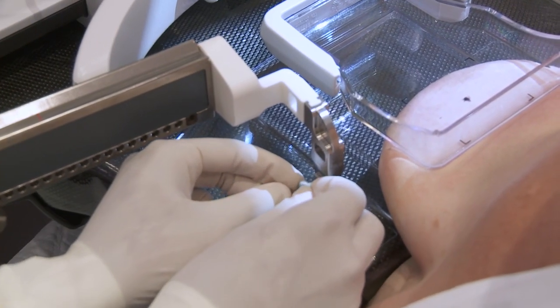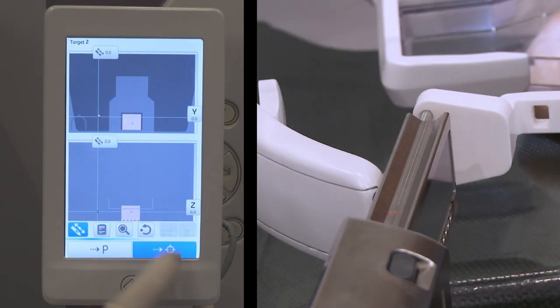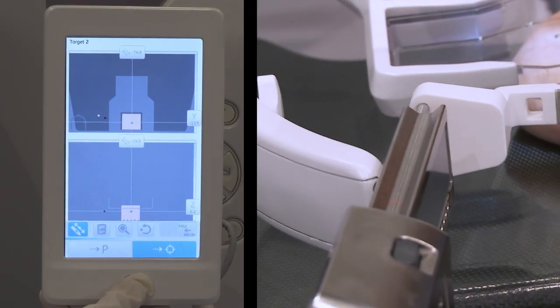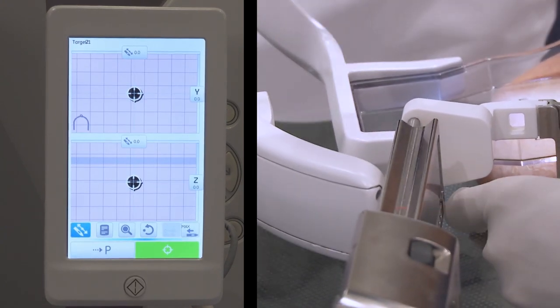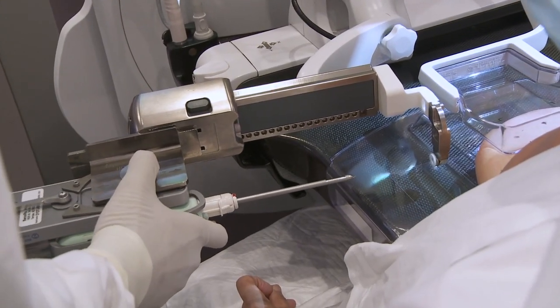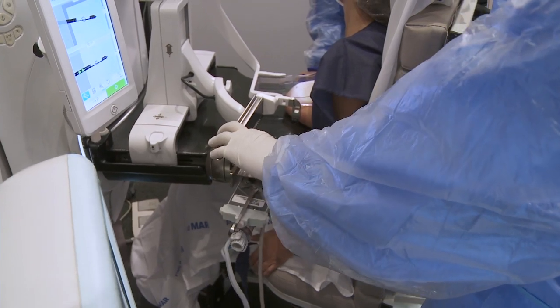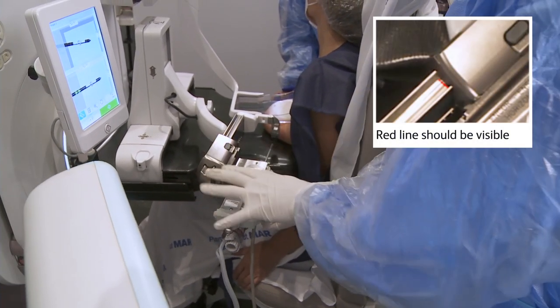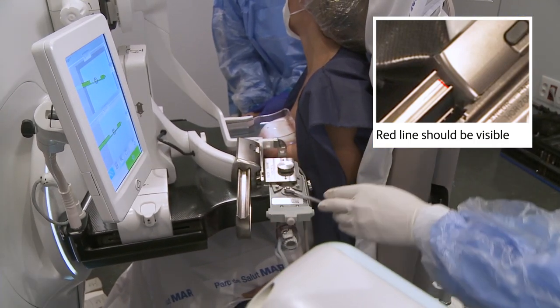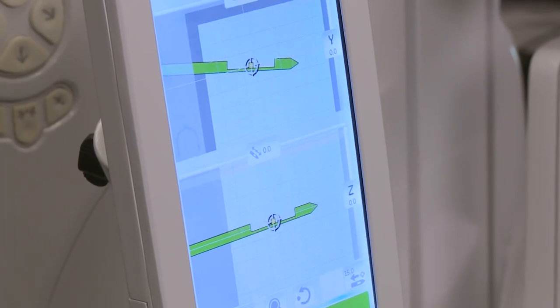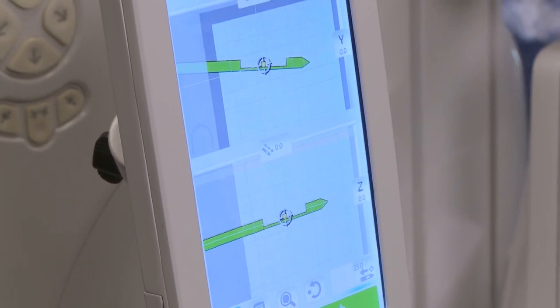Insert metal and plastic N-Core 10G needle guides. Touch the target button and go to the new target coordinates. Attach the horizontal approach adapter with the N-Core device, ready in pre-fire position, to the biopsy head slider. The slider is driven manually all the way. The biopsy display shows the needle notch versus target when in post-fire position.